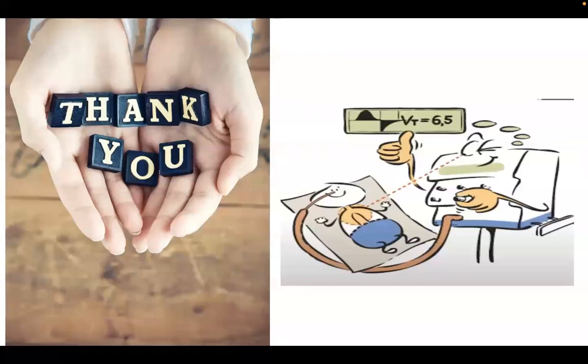Another thing they have mentioned is that as the baby is growing, just like we change the antibiotic dose and fluid rate, similarly we also have to increase the tidal volume.